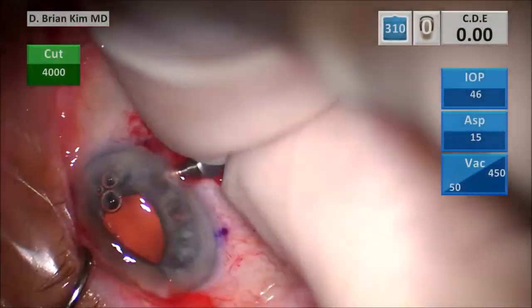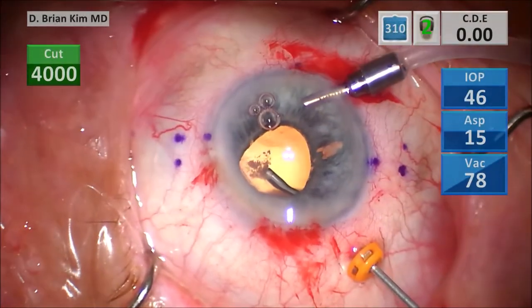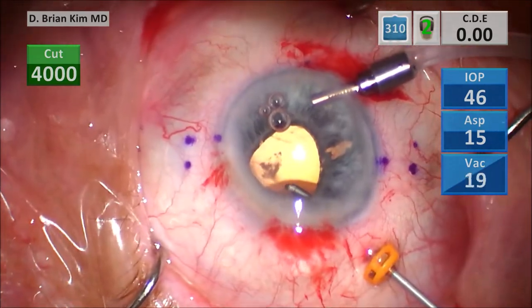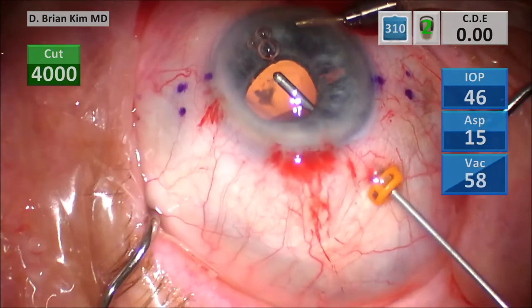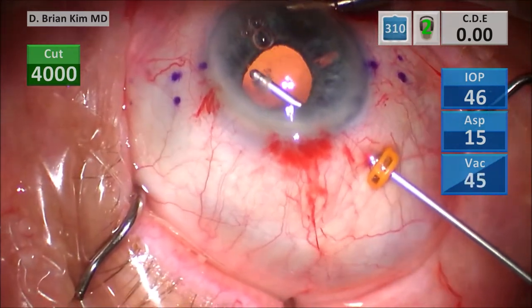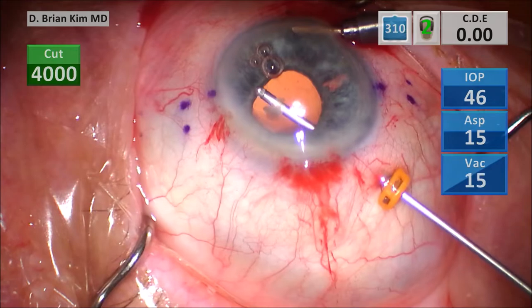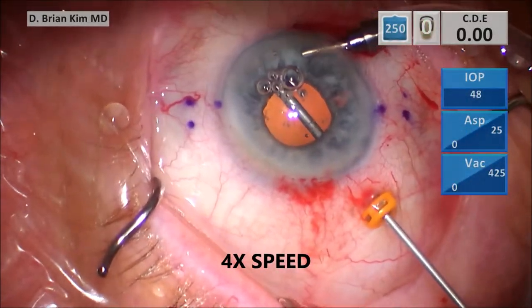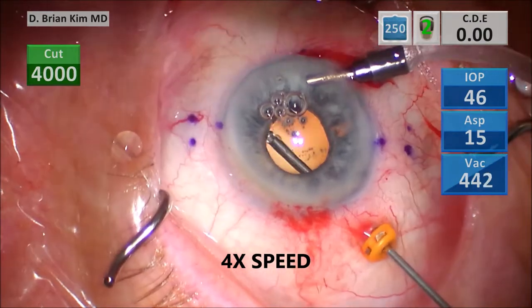This is a 20-gauge Lewicki AC maintainer, and then I'm going to start vitrectomy. Pay attention here — this is very important when you're troubleshooting these cases. As I'm doing vitrectomy, notice a bolus of fluid or vitreous coming through the main wound — that's because the vacuum was not high enough. I had to tell the technician something wasn't right; I don't believe the handpiece was primed properly. We went back and did it again, and now I have good vacuum and aspiration and I'm able to do the vitrectomy adequately.